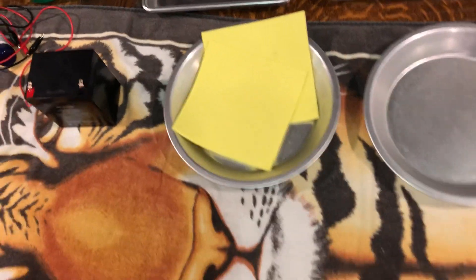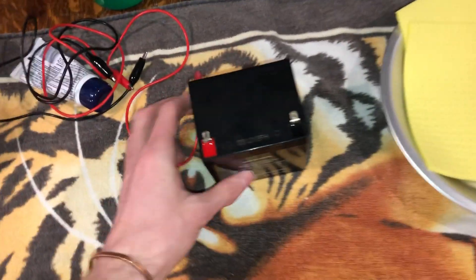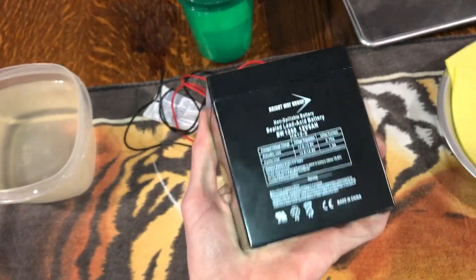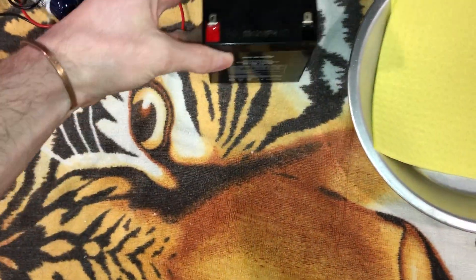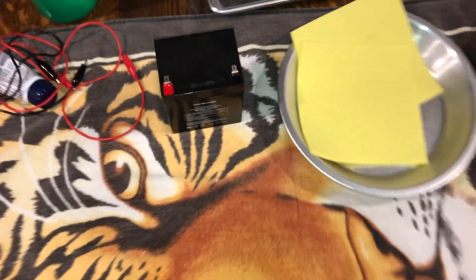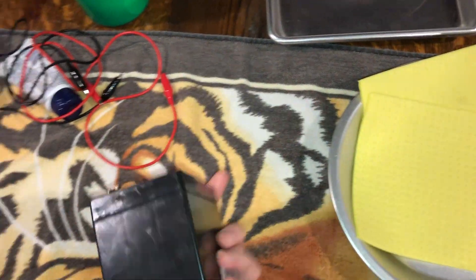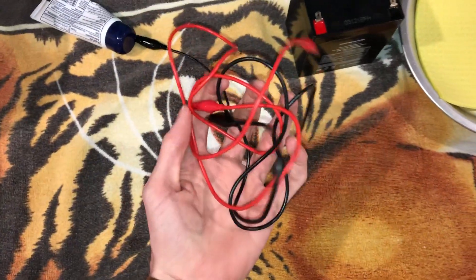For your hands you need some sponges — super thin sponges. You need a battery; this is a 12 volt, but it doesn't have to be. It can be more or less depending on your state of hyperhidrosis. Mine I would consider pretty bad, and 12 volt has been working well for me. You're also gonna need some alligator clips.